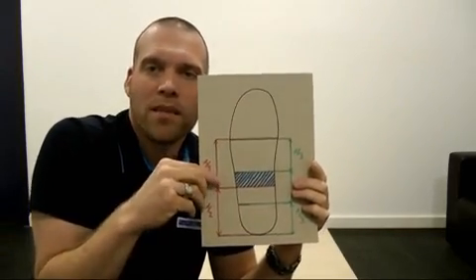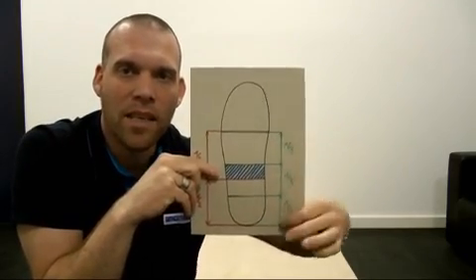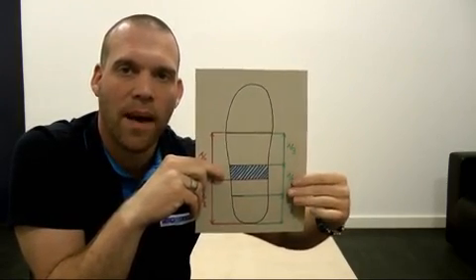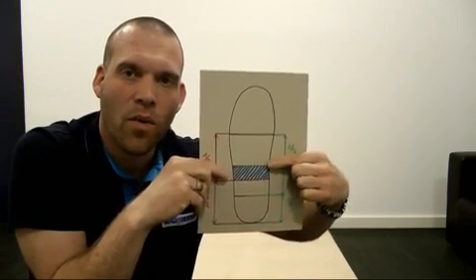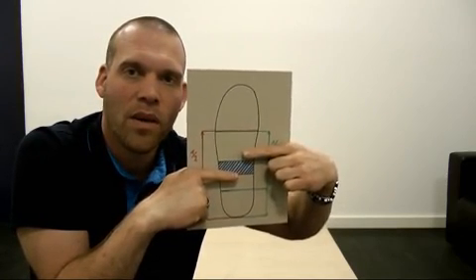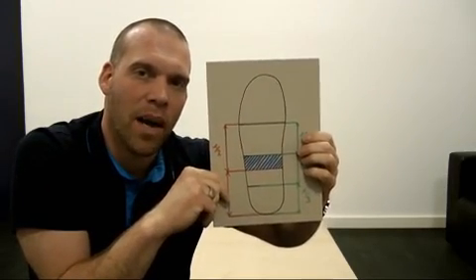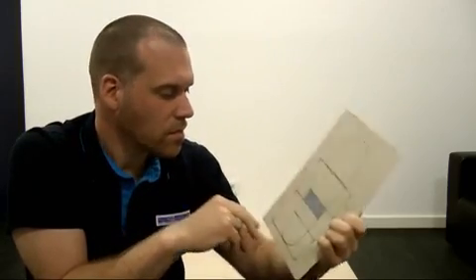Now, in order to delimit the hatched section, we divide this area shown here in green into 3 parts. 1/3 is in front, 2/3 in the back. We take the second line that divides the front third and the midline, and this small area that lies between the 2 markings is quite exactly the place where the plumb line of the center of gravity should fall.